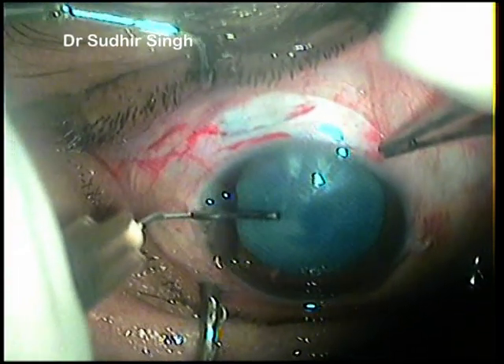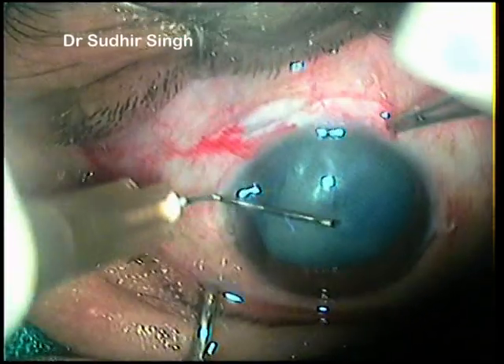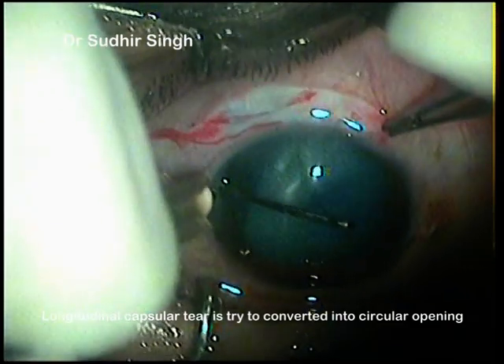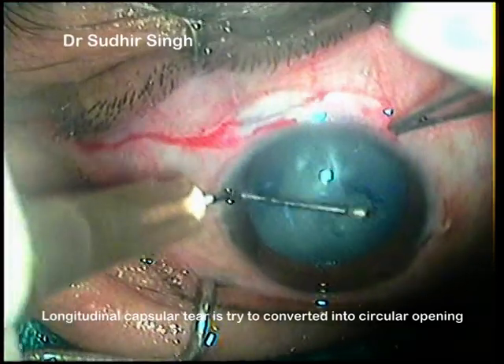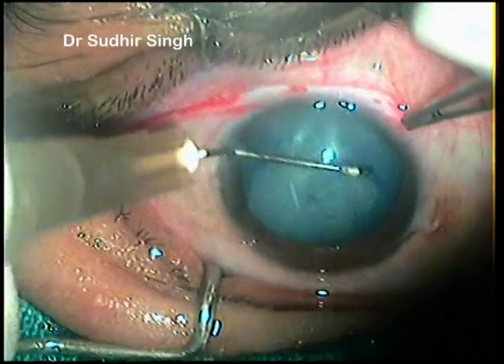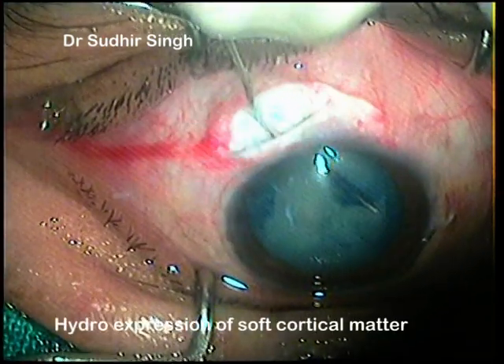The capsular rhexis was started with a 26-gauge needle cystatome from the side port. Anterior capsular radial tear extension — also known as Argentinian flag sign — happened just after starting the capsular rhexis. The vertical opening in the anterior capsule was then converted into an almost circular opening by can-opener capsulotomy.